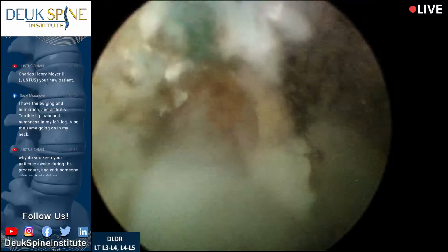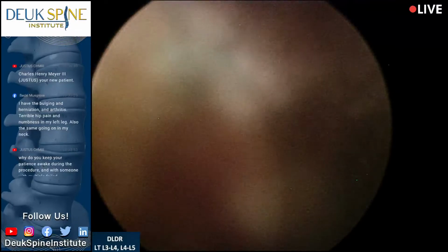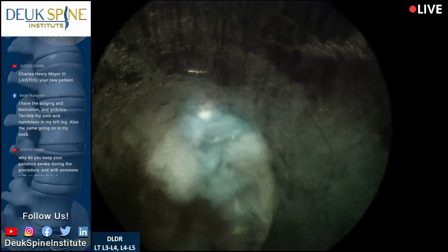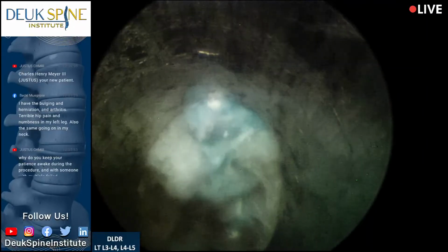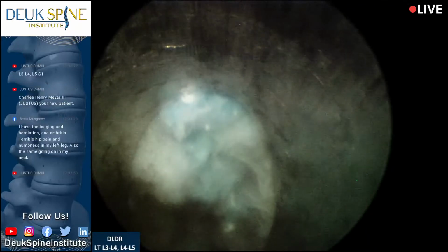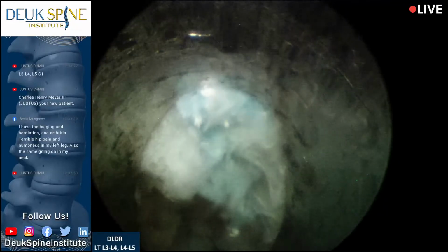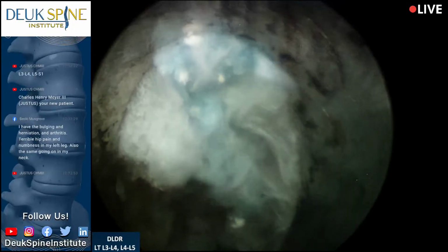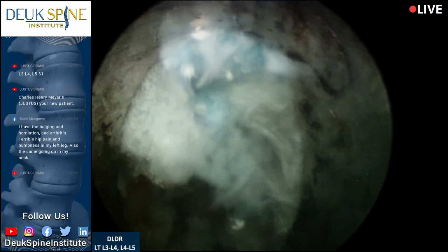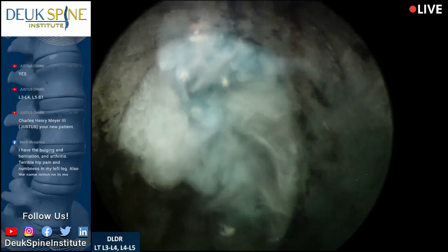And then a comment from Becky Musgrove on Facebook. She said, I have the bulging and herniation and arthritis, terrible hip pain and numbness in my left leg, also the same going on my neck. Yeah, Becky, it sounds like you got herniated disc in your neck and lower back. We can definitely help you. All right, take a look at this. See the blue streak goes up and down? That is the herniated disc stuck within the annular tear. And that's what we're here to treat, okay?